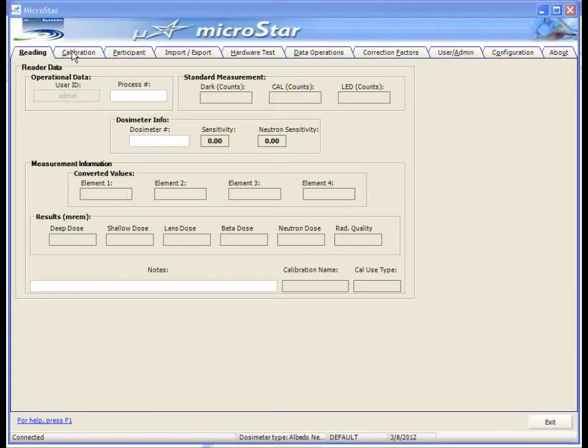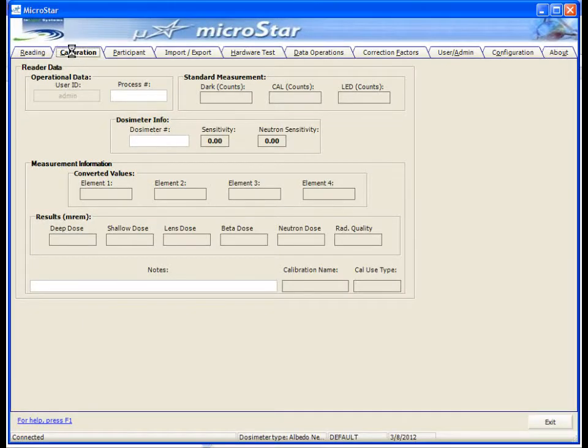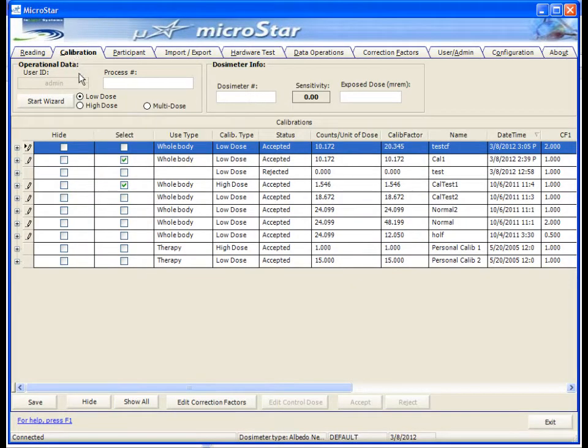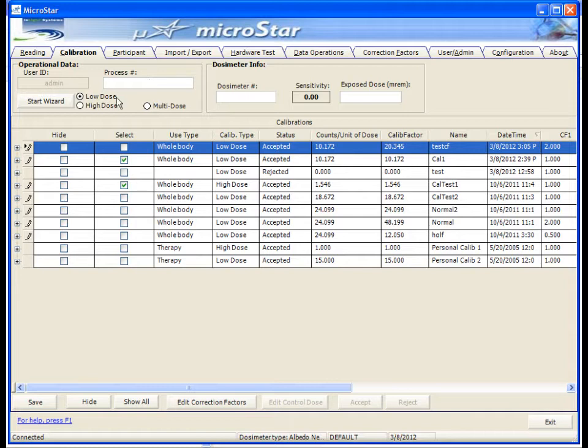To begin calibration, click the Calibration tab of the MicroStar software. Then select the dose range you wish to calibrate for. If desired, enter in a process name in alphanumeric characters.